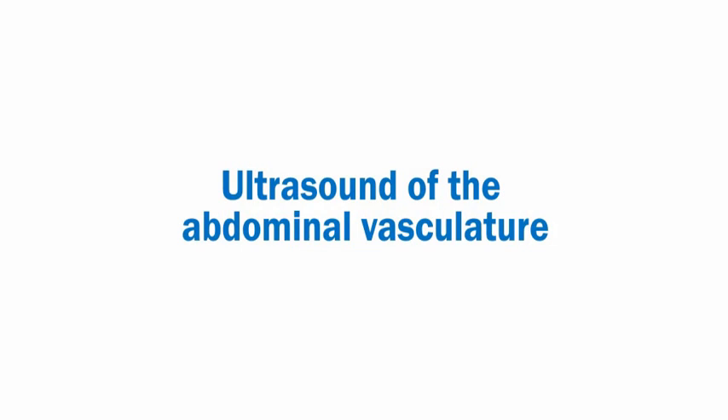This video demonstrates how to set up and perform ultrasound of the abdominal vasculature.